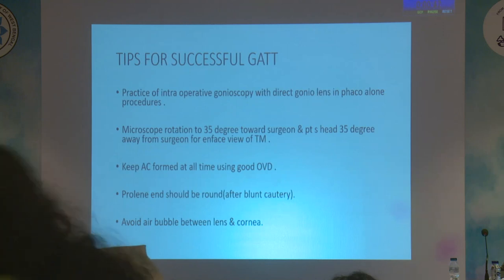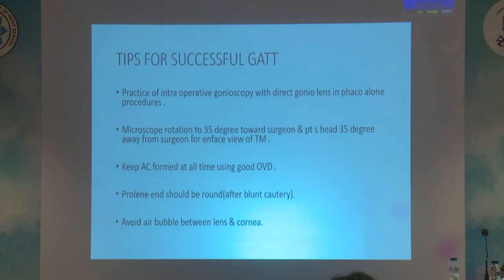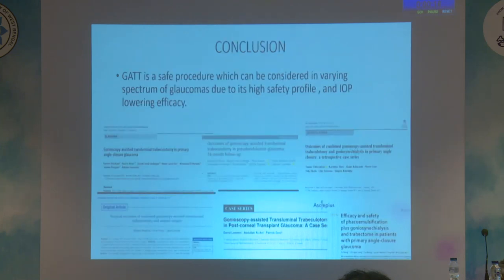For a successful GATT, the practice of intraoperative gonioscopy with a direct gonio lens in phaco procedures should be started first. The microscope is rotated 35 degrees towards the surgeon and the patient's head 35 degrees away from the surgeon for an en face view of the trabecular meshwork. Keep the anterior chamber formed at all times using good viscoelastic.